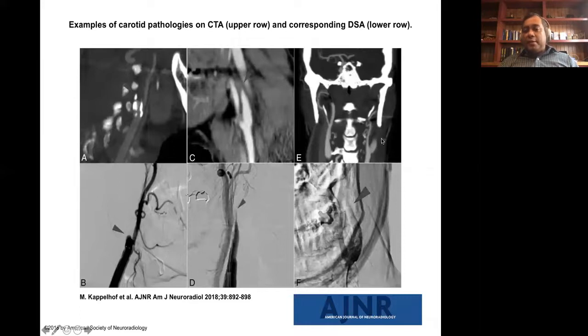And then finally here on the CT angiogram, you see what I call pseudo tapering, where you see some tapering, but it's a little bit hazy here, right? This is the classic pseudo occlusion or the false occlusion. And then on the digital subtraction angiogram, you'll see that you're able to push a catheter forward. This can happen if you have a distal IC occlusion, as you see here.